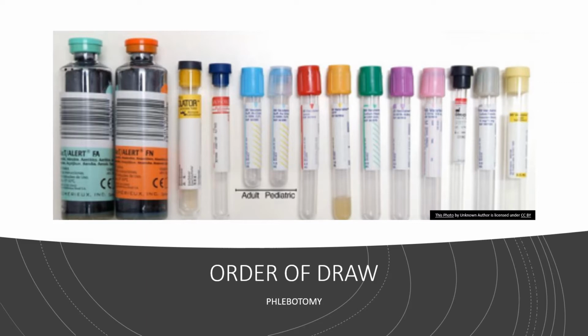Then, of course, green, purple, that pink or variation of a purple lavender is exactly the same. A pink tube is exactly the same as a purple top tube, except typically they use those purple top tubes almost exclusively in blood bank. We go down to that gray top tube, and the gray top tube is the last one that we're going to talk about. There are multiple other tubes out there.